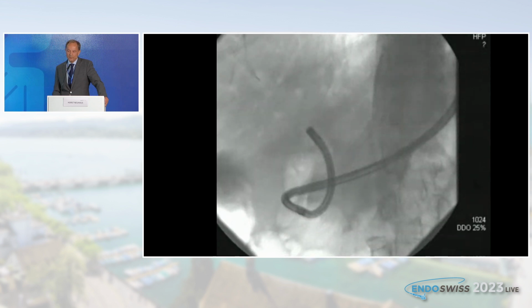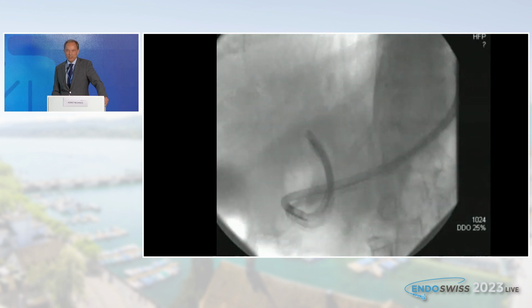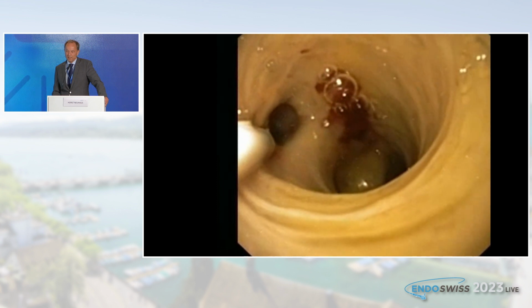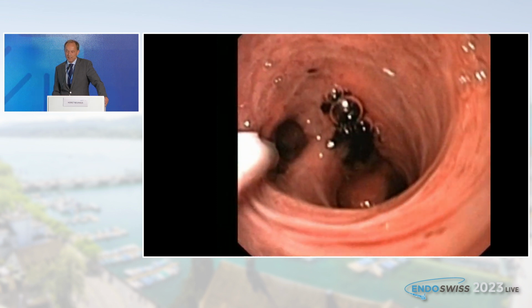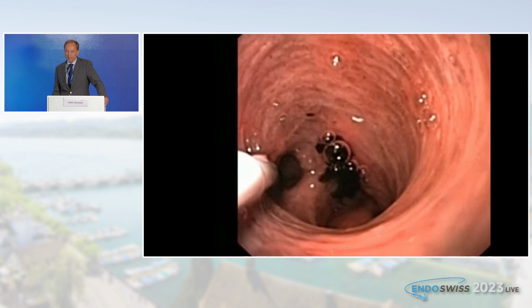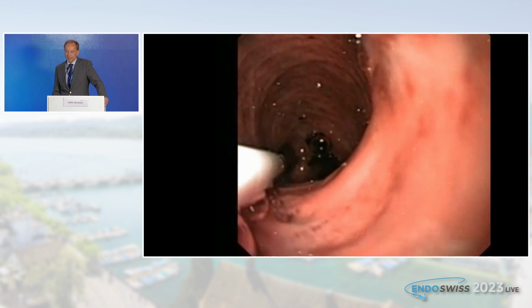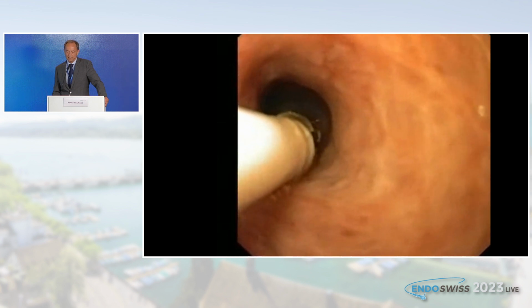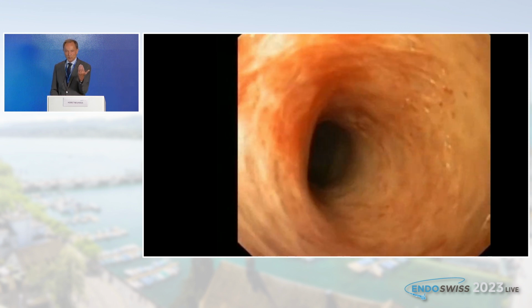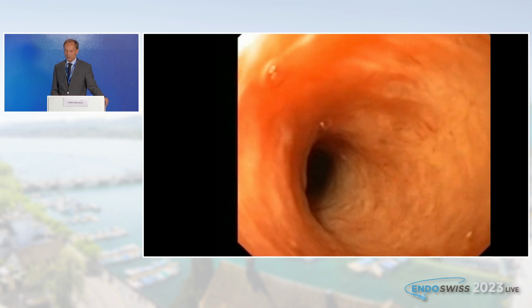As shown here, a balloon is inflated in the right hepatic duct, and then by pushing and pulling, we can advance the pediatric gastroscope into the CBD. And as you can see, we get excellent image here with NBI. This is the hilum. Obviously, the balloon catheter is in the right hepatic duct. The challenge is when the instrument is not in a stable position and you remove the balloon, then there is a potential risk that it slips back towards the papilla.